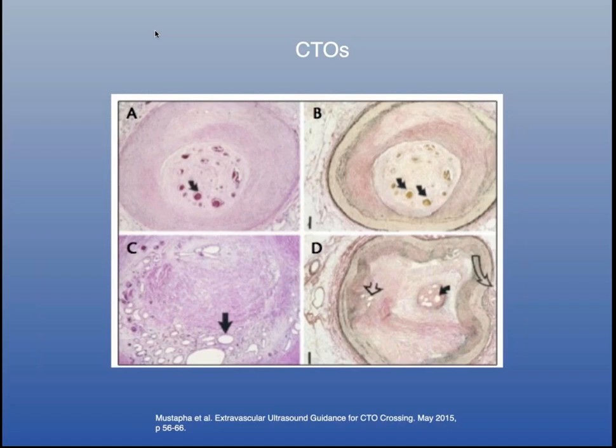If you talk to IRs, you'll get a little bit of a third here, a third there, and a third there. It just depends. When you talk to vascular surgeons, a lot of them tend to be more into 035 systems, and that just depends on training and so forth. Obviously, I'm generalizing, but overall, people that become experts in this stuff will understand all the different guide wire diameters and systems that can be used.